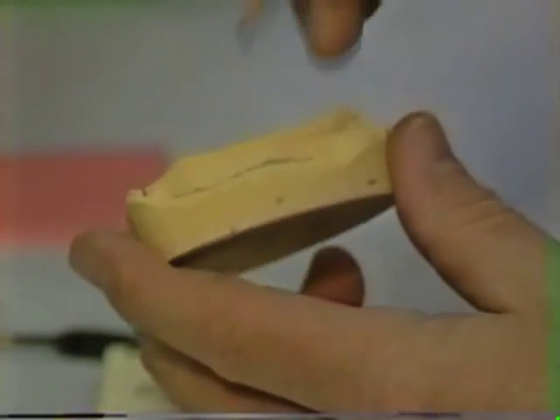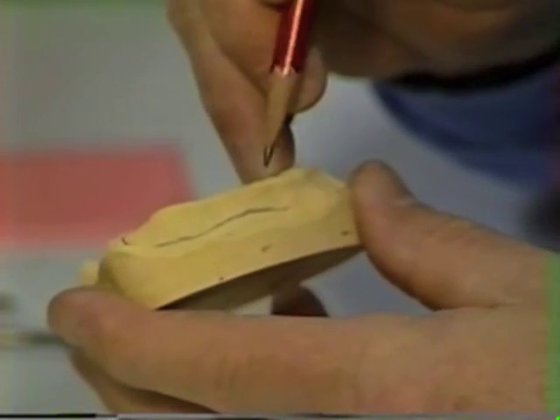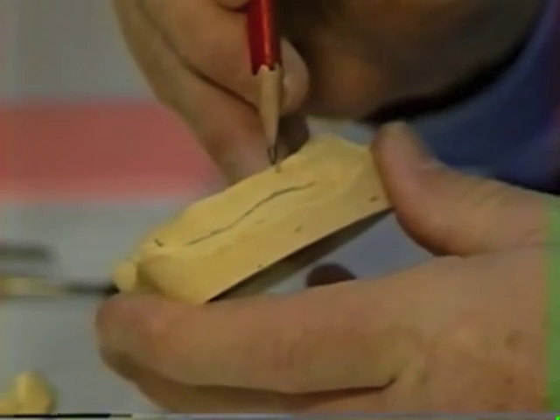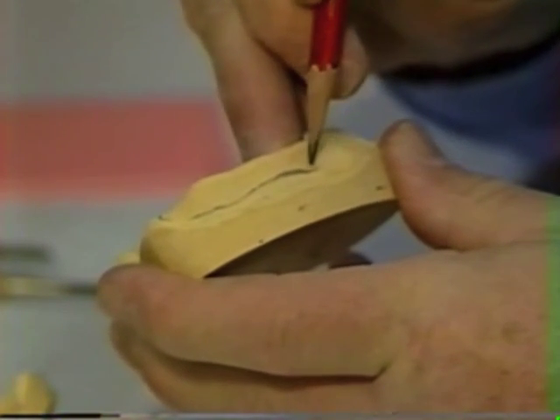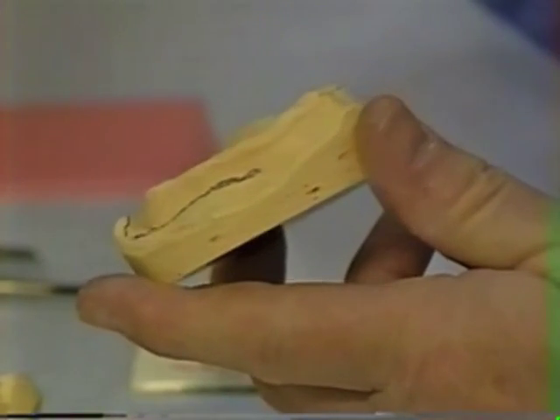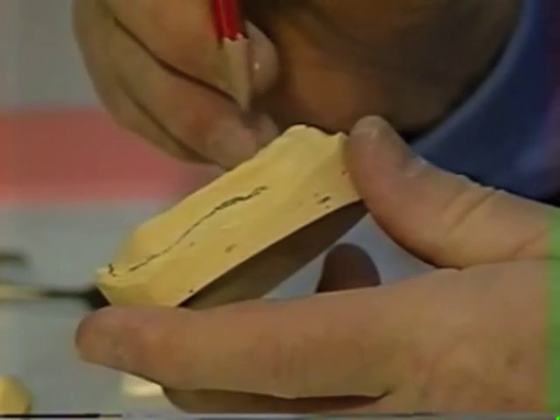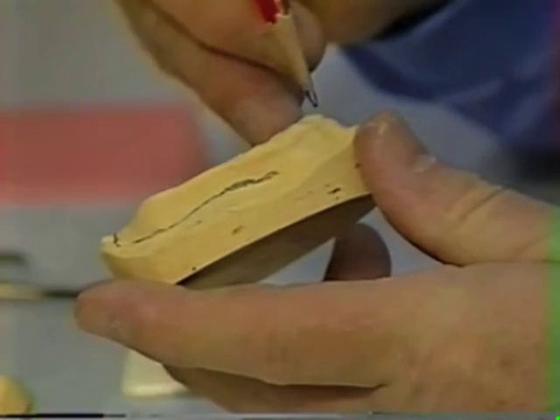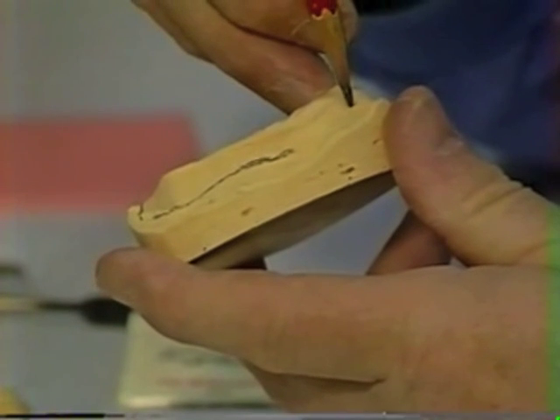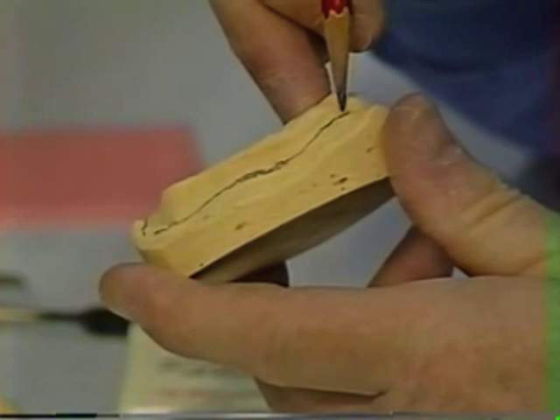Then on this cast it doesn't show the buccal frenum very well, but we know that in the area of the first premolar, second premolar, there's going to be a buccal frenum, and we want to make sure that this tray skirts that buccal frenum about like so. So it'll form sort of a little notch right in this area. We need to remember what the mouth looked like, what the depth of that mucobuccal fold was, and basically it was fairly shallow in the mouth, so we want to remember that. I'm going to guess that this is about the length that we saw in the mouth.